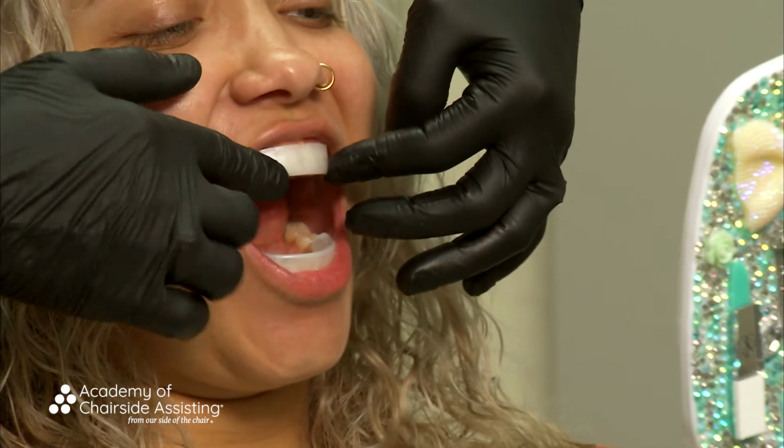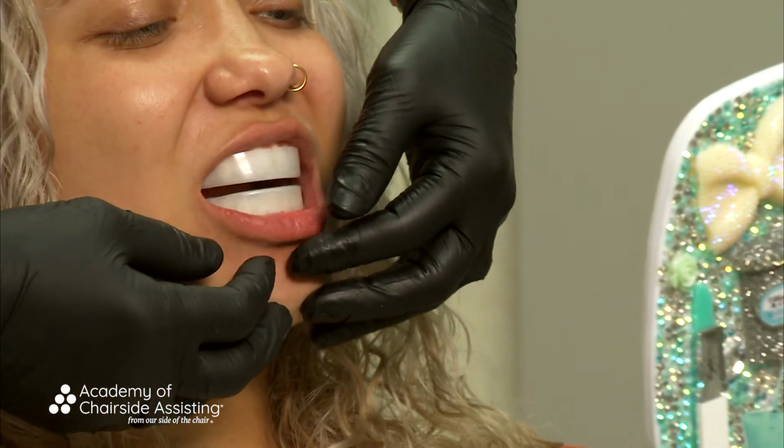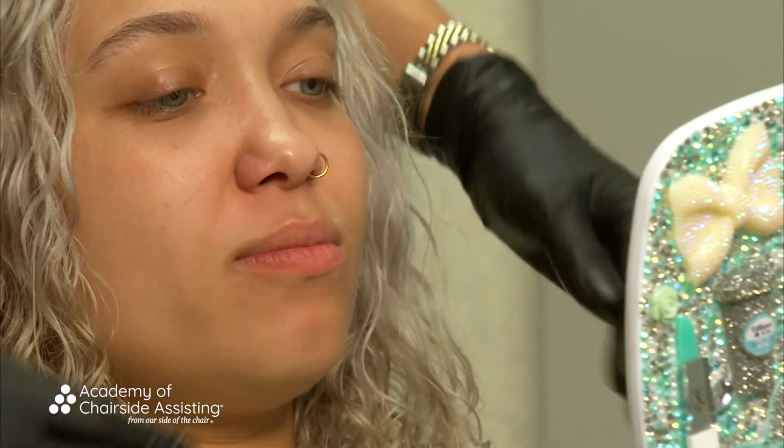Now I want you to close ever so slightly, bring your teeth together and close all the way just a little bit. And I want you to kind of, almost like you're going to kiss, right? And kind of wrap your lips around that. Kind of suck it in like this. Watch me. Okay, kind of suck it in. There you go. And then put your lips around it. And you're just going to close just ever so slightly, just like that, okay?